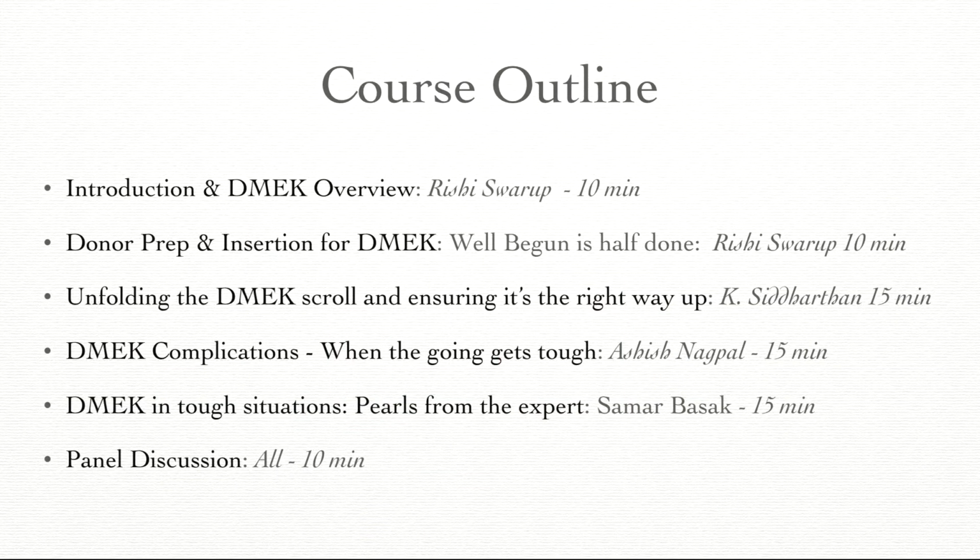Like I said, we'll start with an overview of DMEK and then some points about donor preparation and insertion, followed by a talk on how to unfold and ensure it's the right way up, some complications, some simple ones and some dreadful ones, and then some tough situations from the expert. Then we'll have the keynote address followed by a panel discussion.